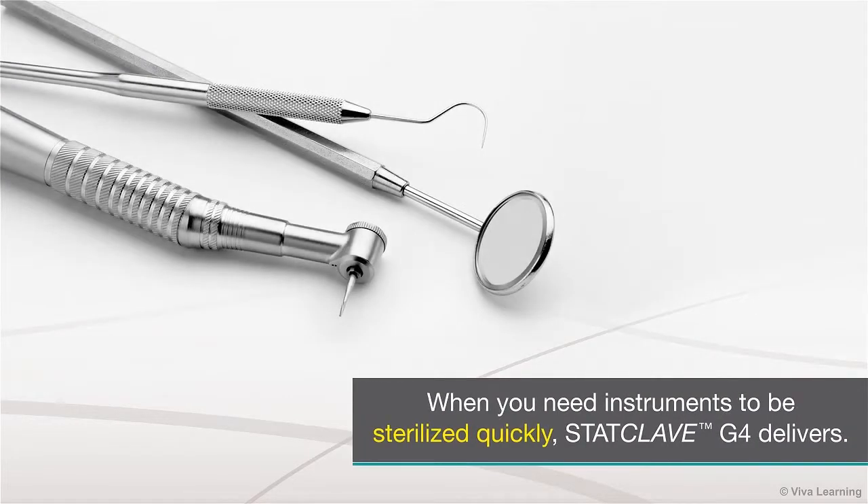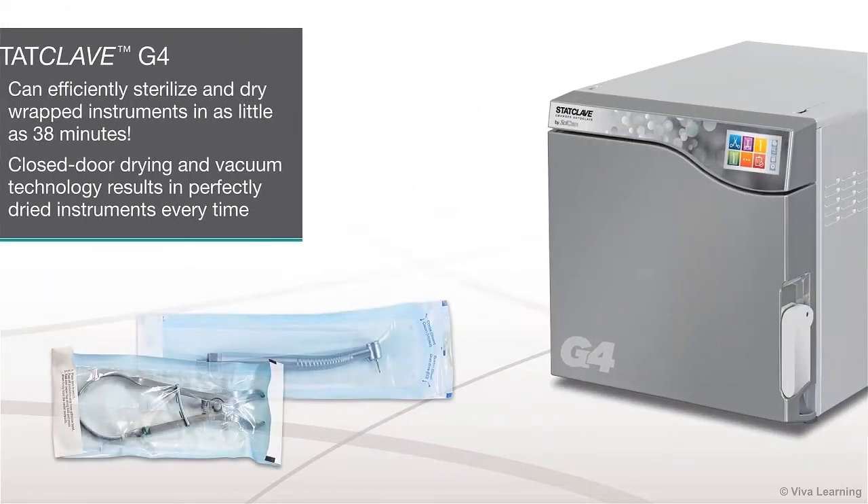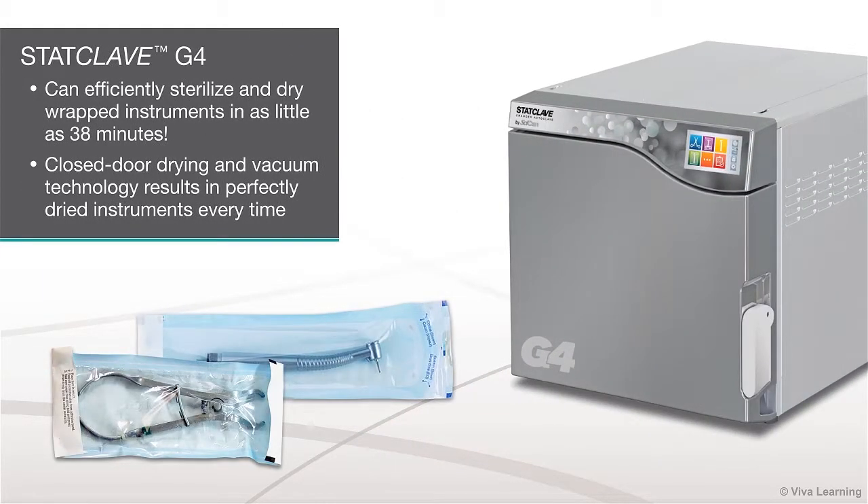When you need instruments to be sterilized quickly, StatClave G4 delivers. In fact, StatClave G4 can efficiently sterilize and dry wrapped instruments in as little as 38 minutes. Plus, the unit's closed-door drying and vacuum technology results in perfectly dried instruments every time.